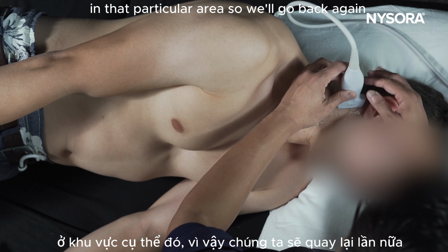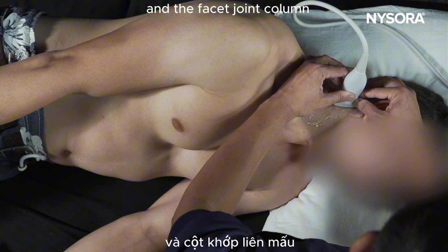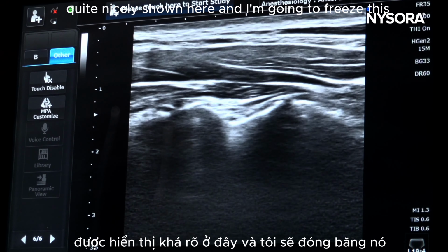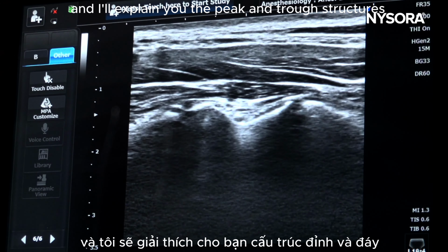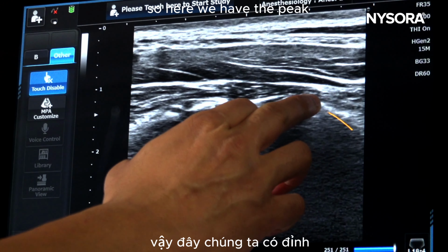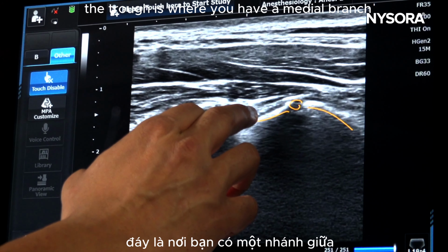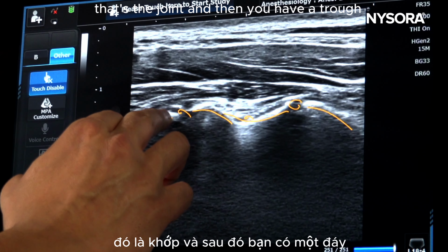So that way you could do a third occipital nerve block in that particular area. So we'll go back again and I'll show you the whole cervical medial branch and the facet joint column in one view, and now you can see the whole image quite nicely shown here. And I'm going to freeze this and I'll explain the peak and trough structures. So here we have the peak, and the peak is where you have a joint, and then you have a trough. The trough is where you have a medial branch.